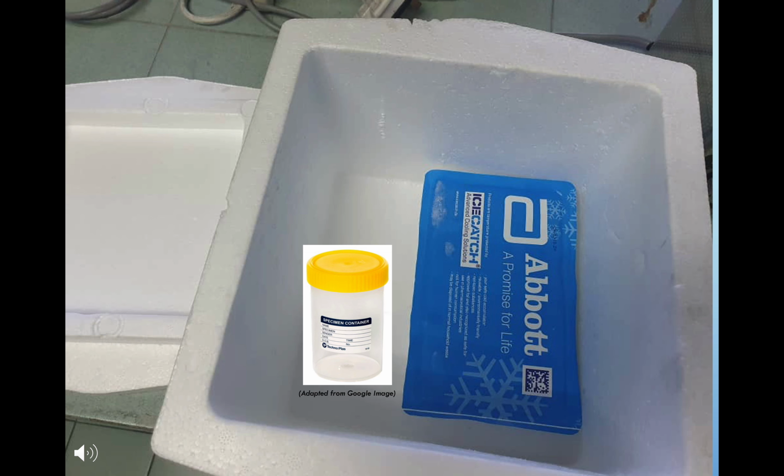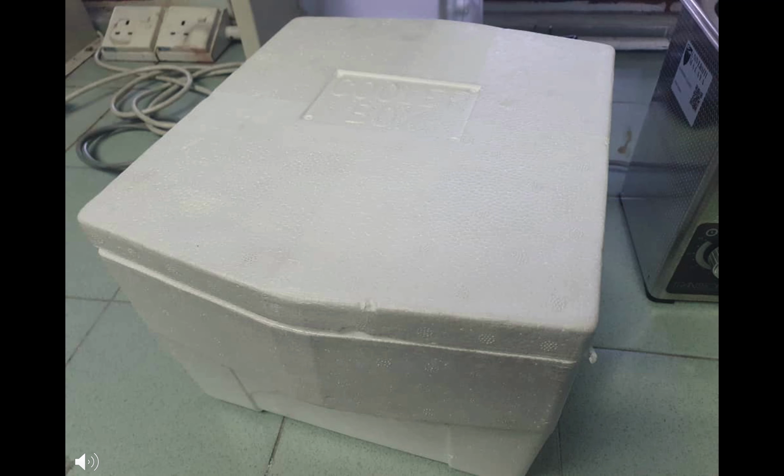Get ready a polystyrene box like this with an ice pack inside the box and place the specimen bottle inside the box. Close the box with the lid and send it to the lab as soon as possible or immediately. And if you have liquid nitrogen as a cooling material, you can use it as well.